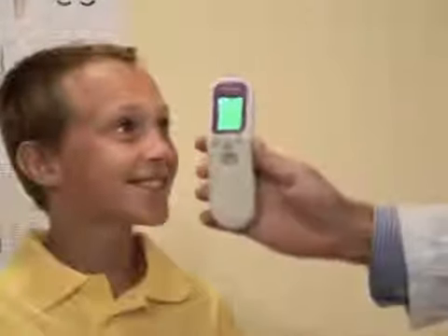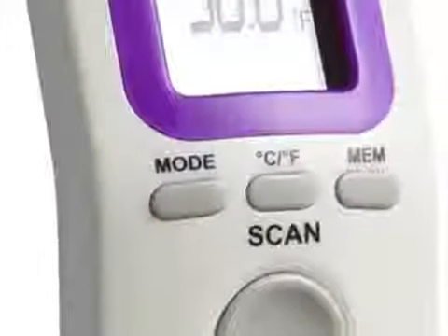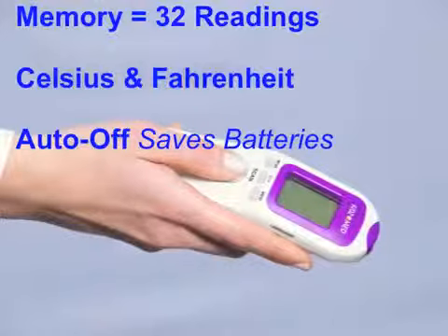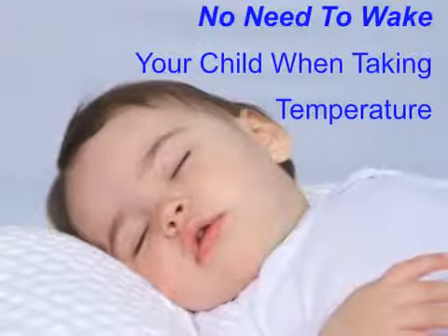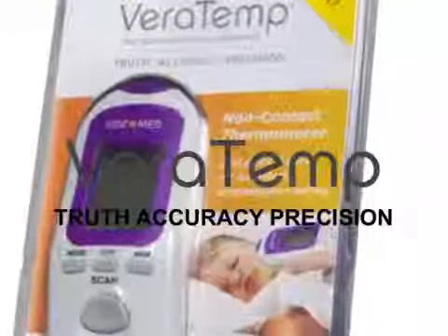The VeraTemp can display temperatures in both Celsius and Fahrenheit and has a memory feature that records the previous 32 temperatures. The VeraTemp is the only thermometer you'll need for your home and family. The VeraTemp delivers truth, accuracy, and precision. It's temperature-taking redefined.